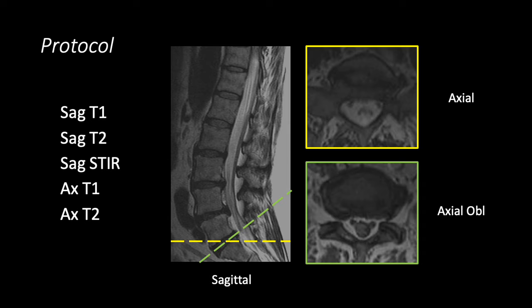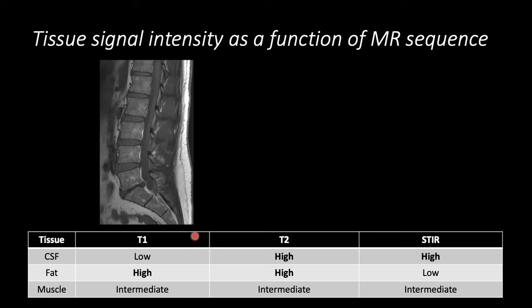There are different sequences, and all the sequences show the same anatomy. However, the signal intensity — the relative brightness and darkness of tissues with respect to one another — will differ depending on the sequence used. For example, on T1-weighted sequences, fat is bright, and you can see the bright signal of the subcutaneous fat as well as the epidural fat inside the spinal canal outside of the thecal sac. CSF signal is low, and you can see that dark signal inside the thecal sac here.